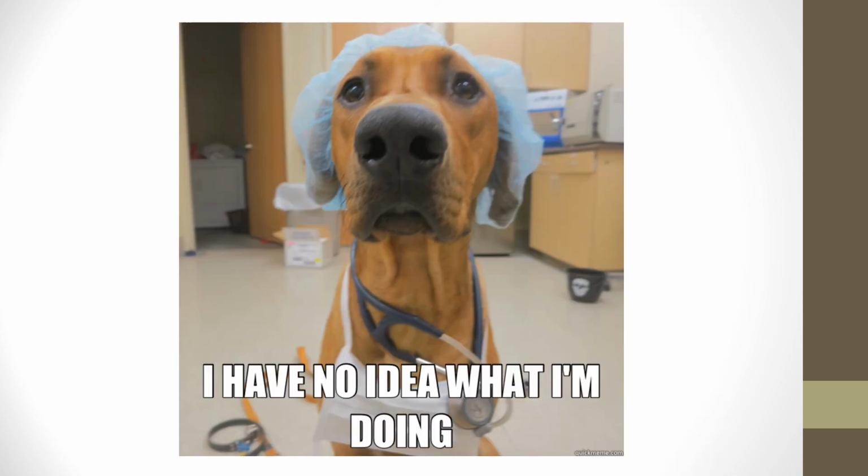All right, so hopefully go through this slowly. Like I said, separate the different tests, the indications, what they measure. Go through practicing interpreting some of those like we did with restrictive, obstructive, or combined when I give you those values. Practice the best test situation where you had to pull the best number for the FVC, the best number for the FEV1, and then you had to calculate separately those two numbers, what their FEV1% was. Then you had to calculate which of the three tests had the best flow rates to use. Remember, you'd use the sum of the FEV1 and FVC, and the flow rates from that one we're going to use for the best test. So be sure to practice this stuff, go through it, don't take it lightly, make sure to read your material as well.